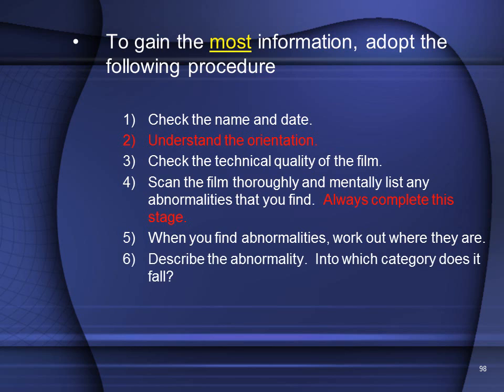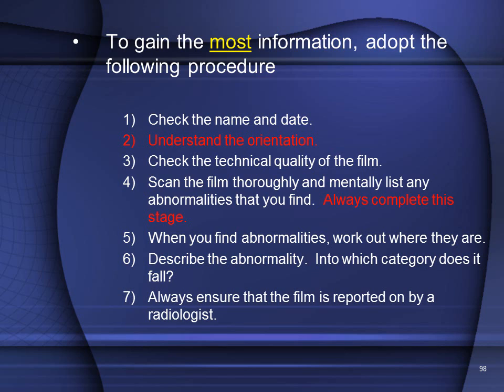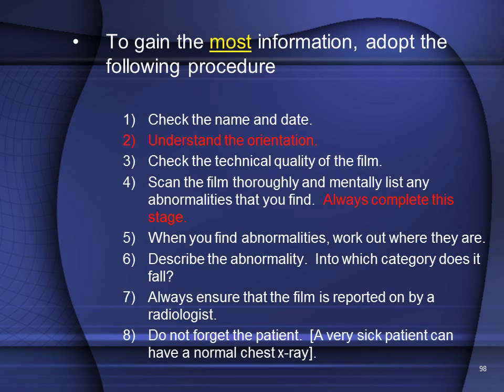Number 6, describe the abnormality. Into which category does it fall? Is it too dark? Is it too light? Is it too large or in the wrong place? Always ensure that the film is reported on by a radiologist. And lastly, never forget the patient. Understand that a very sick patient can have a normal chest X-ray.